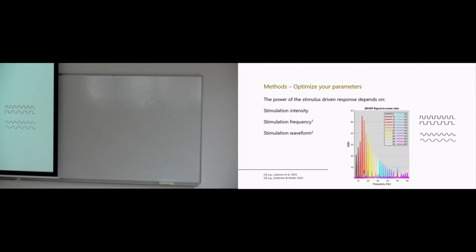There's one study that shows how to interpolate frequencies that you don't naturally have on a given computer screen using an approach closer to a sinusoidal function. Apparently, in that case it didn't really do much in terms of the amplitude of the steady-state response. So maybe you're safe there. But it's certainly something to look into if for some reason your experiment necessitates a deviation from the standard square wave on-off approach.